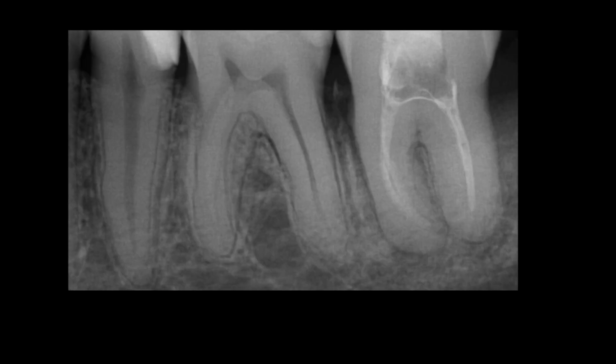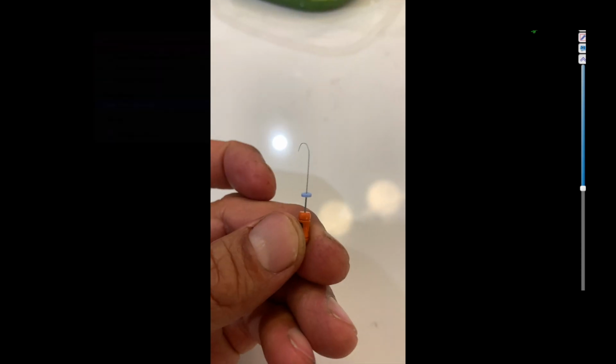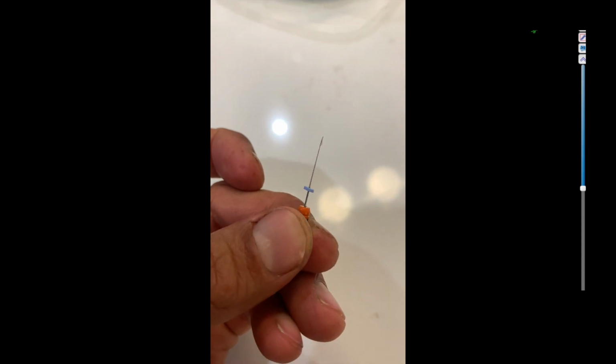Roughly 2 to 3 weeks later, we did an initial pulpectomy, and we placed calcium hydroxide. I don't have the pulpectomy here, I have the completion of the case. During the pulpectomy, I couldn't get patency on any of the canals on the mesial. There are 3 canals in this tooth, and I didn't know what was going on, because my file was doing a U shape in the mesial canals. It was almost like a horseshoe.